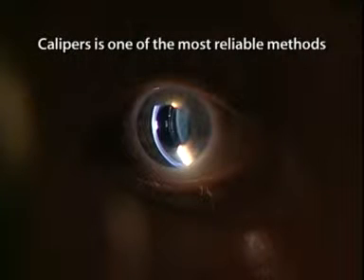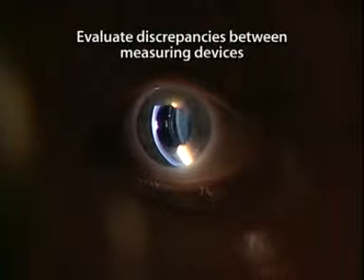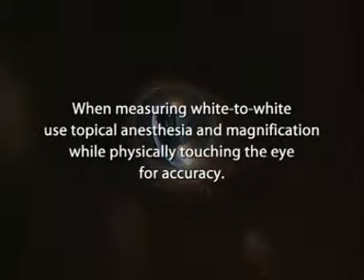Physical measurement with calipers is one of the most reliable methods for obtaining the measurement. Validate the measurement with a corneal topography unit, such as Orbscan. Evaluate any discrepancies between measuring devices. Sometimes a pterygium or other anomaly can cause a discrepancy, as can improperly calibrated calipers. When measuring white to white, use topical anesthesia and magnification while physically touching the eye for accuracy. Remember, the ICL is not recommended with an ACD of less than 3 mm.